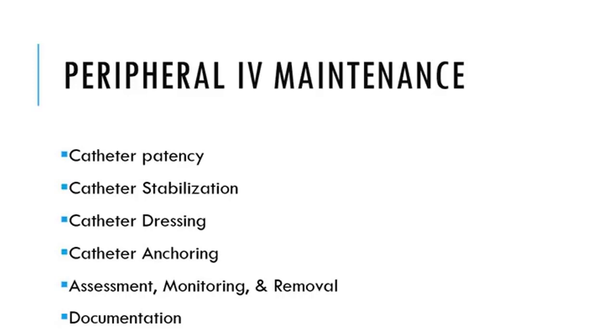We want to get that peripheral IV out as soon as we are finished using it and when it's no longer used, just to prevent any type of complication or infection. And then, of course, documentation. We all know that documentation is a key aspect of what we do as nurses, and it's no different with IV catheters. We need to be documenting the location, what the dressing looks like, how many times it took to get the IV inserted, was it multiple attempts, and then of course that we're flushing, that we're assessing, and that we're maintaining that IV as we're supposed to be.